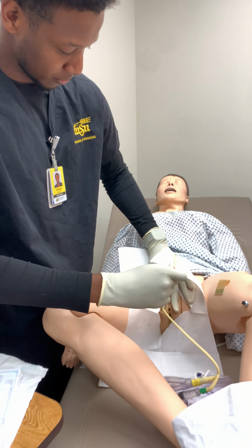I guess we're going to use some real length. You can move that over here for me real quick. Thank you. There we go. So in this case, we got a flash, so I go 2 more inches.